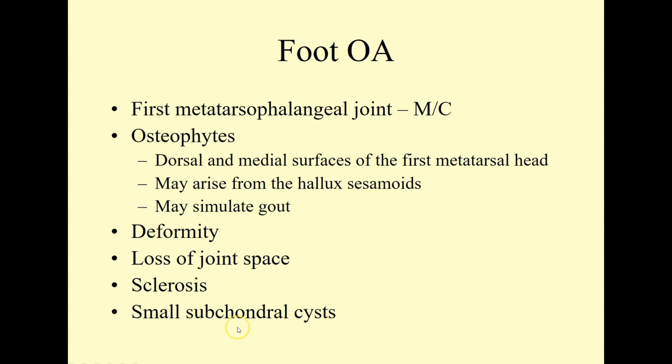Hopefully these are just familiar phrases to you, and I hope you've appreciated that no matter where you go in the body, because it's a synovial joint, here's the features of DJD, regardless of what joint we're looking at.